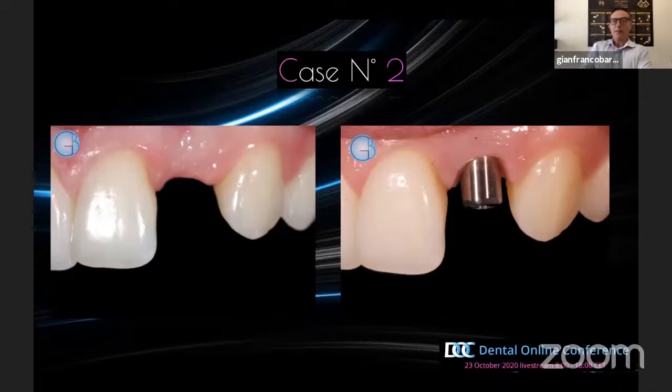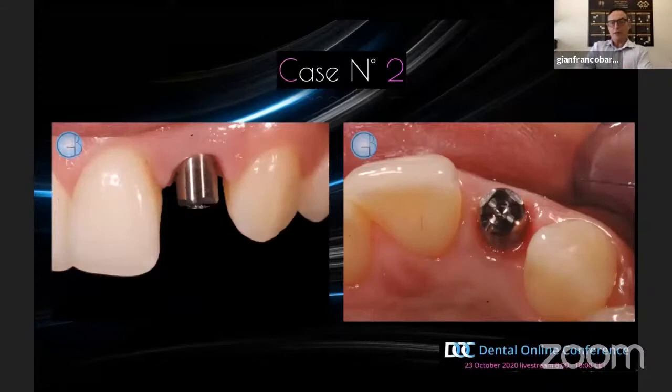In this case, the difference from the traditional way is that the design of the abutment is made on a computer, digitally, and I'm not a big fan of this technique because I cannot manage it personally, and I cannot have the good feedback that I have with the analogic workshop.